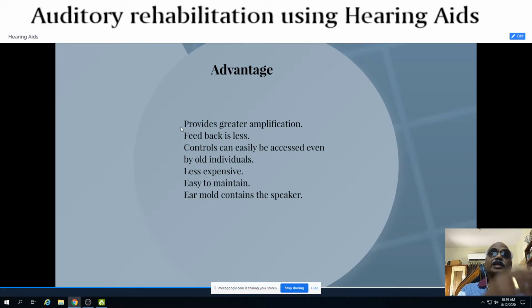And then next comes the feedback. You all know when you switch on the mic, you can get a hiss, hum, all these things. While I'm taking a class, if many of you switch on your microphone, the ambience won't be noiseless; you'll get tremendous feedback. This feedback occurs when the distance between the mic and the speaker is very close. I repeat, feedback occurs when the distance between the mic and the speaker is very, very small.